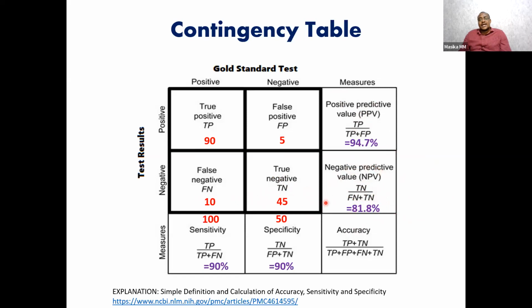If a kit has, let's say, not so bad actually, 80 is very good, but it's low, it means if somebody tests negative, you may want to repeat with a more sensitive test to be sure you have not missed anyone. You can see here you would have missed 10 people who are misclassified. They are called false negatives, yet they are supposed to be positive.